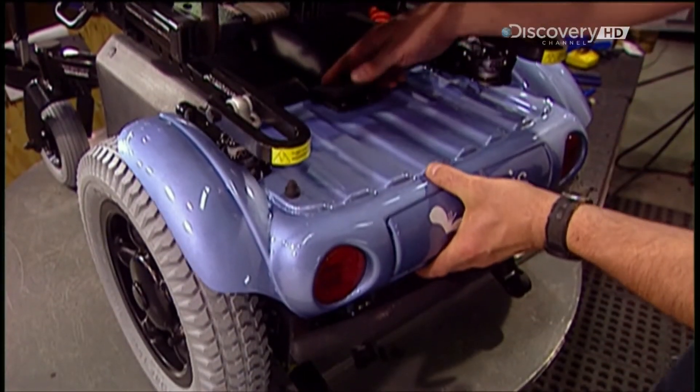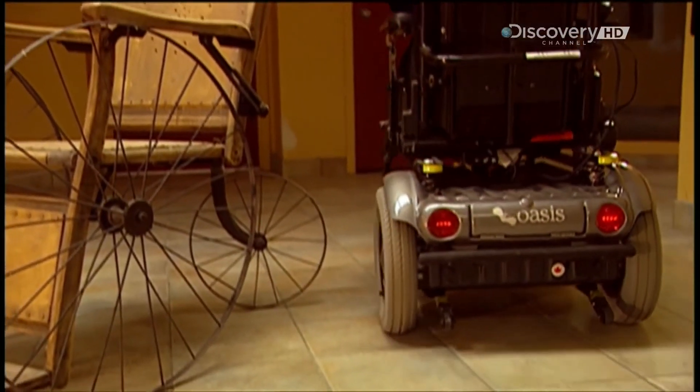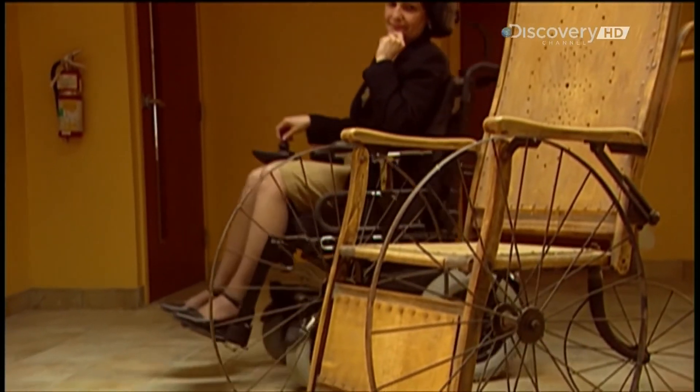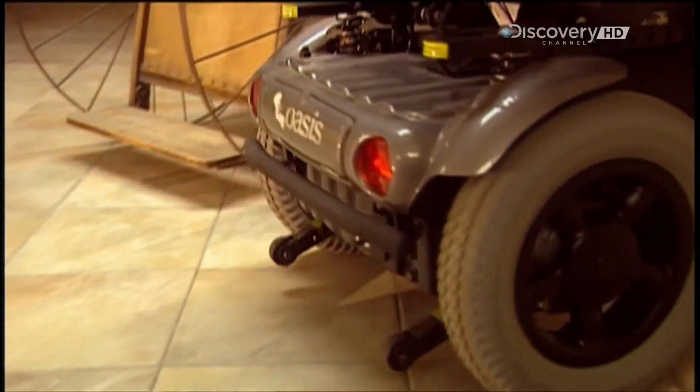A steel bumper and plastic rear hood, called a shroud, protect the back of the wheelchair from the elements and against minor collisions. This motorised model can glide at a leisurely pace, or zoom around at a top speed of 12 kilometres an hour.